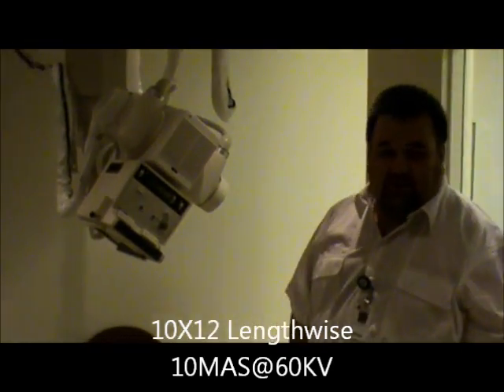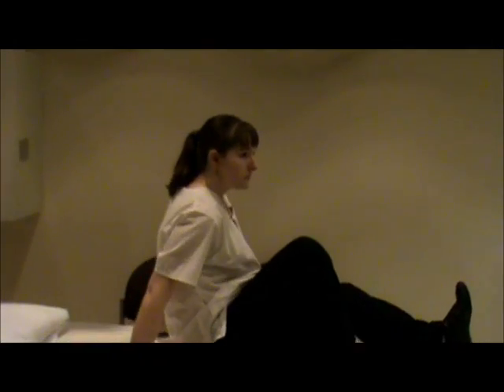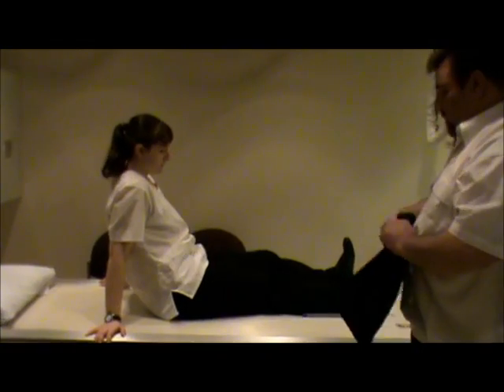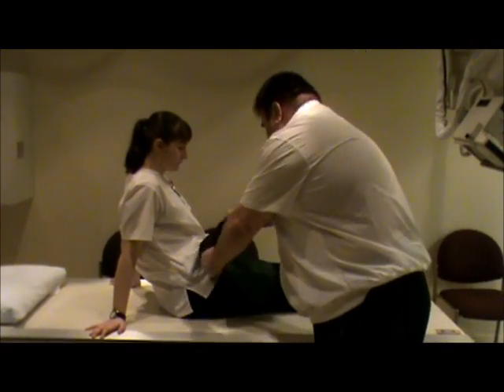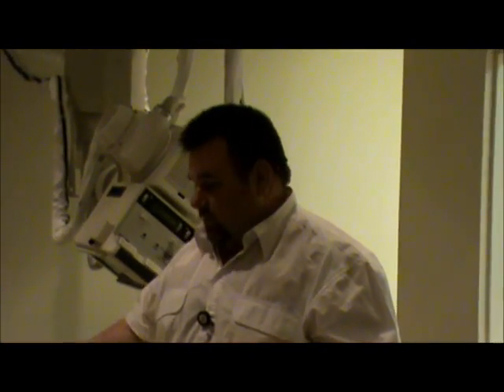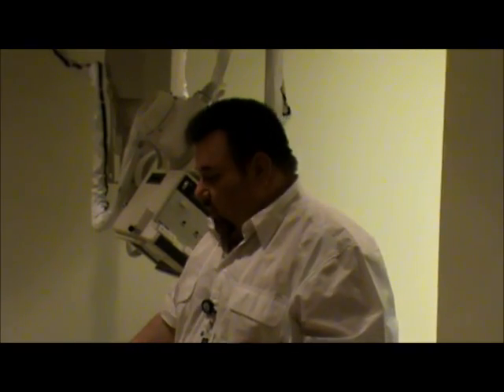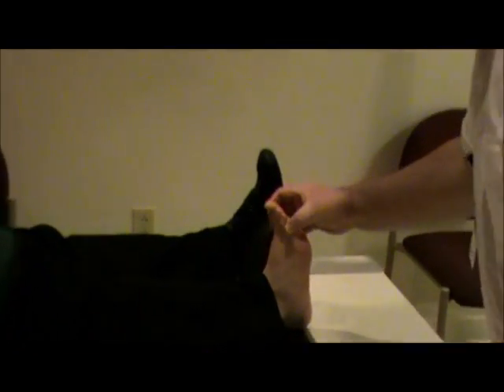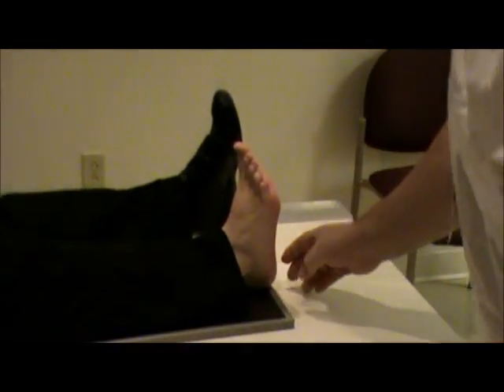The first thing we're going to do is have the patient lying on the table with their sock and shoe off, and have them extend their leg out. We'll lay the shield on the patient. If the patient is unable to bring their foot back, we might have them use a towel, sheet, or gauze to wrap around their foot and pull it back. What we need to do with the foot is dorsiflex it to the point that the plantar surface is perpendicular to the IR.